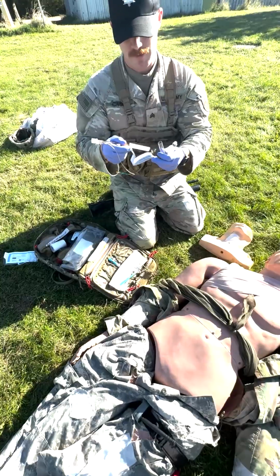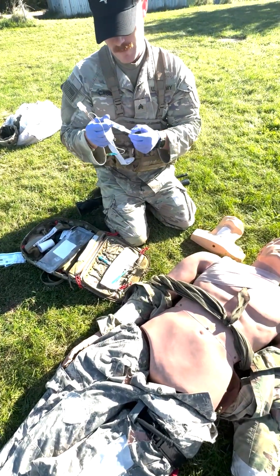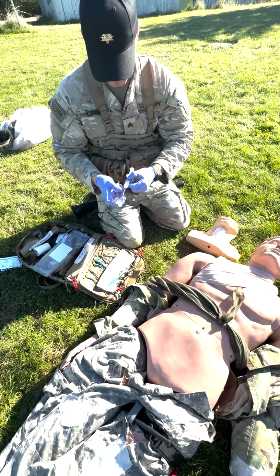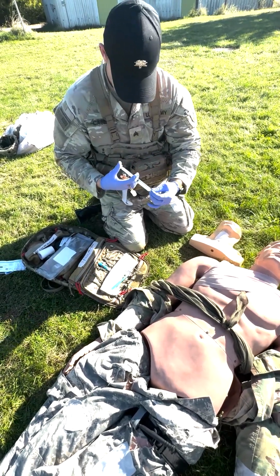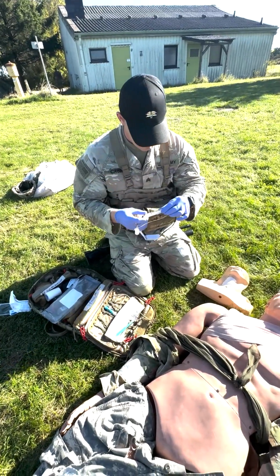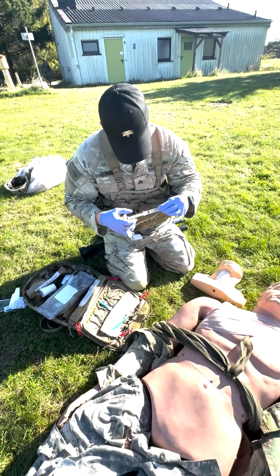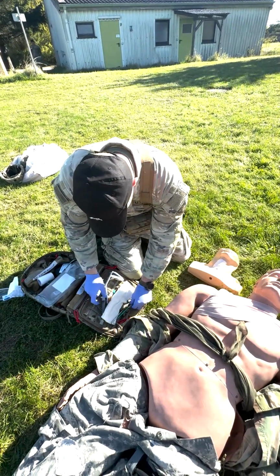Go ahead and take my sheath off. Inflate my balloon with 10 mils of air. Looking for the balloon, looking for the pilot bulb. Equipment is good. Go ahead, set this down.